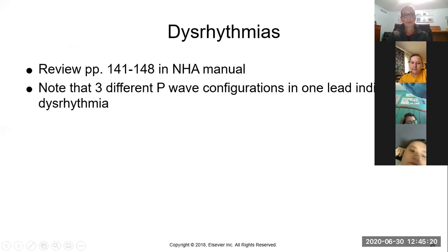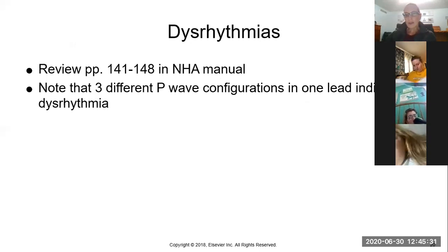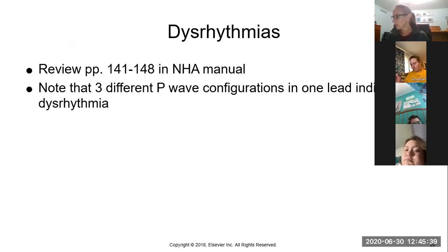Dysrhythmias, let's go to pages 141 to 148 in your NHA book. Okay, so I know that we were going crazy doing all of those reads, okay? But I would have you look over the ones that are listed in this manual, okay?